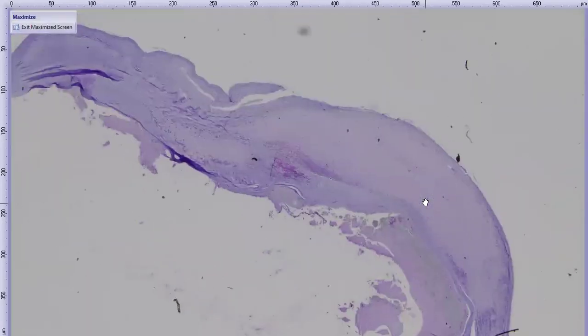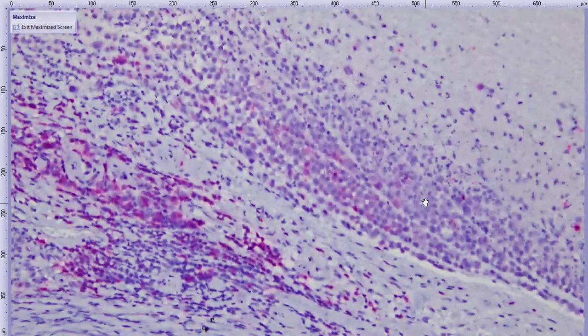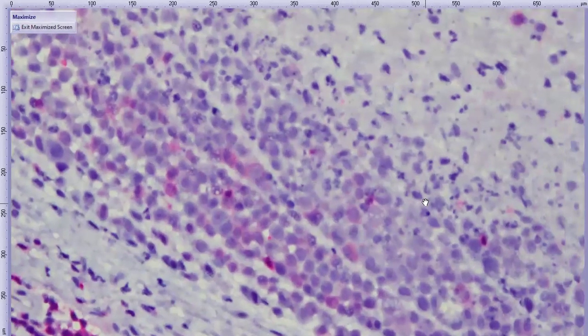This actually I shouldn't even bother putting this up. The CD20 was negative and the CD3 was kind of interesting. There are lots of non-neoplastic lymphocytes picking up both CD3 and CD20 admixed with the neoplastic cells, but with the CD3 at least, the neoplastic cells were actually kind of convincingly positive in some areas. Here, these larger cells that don't really look like normal non-neoplastic T lymphocytes, I was reasonably convinced of some degree of positivity.